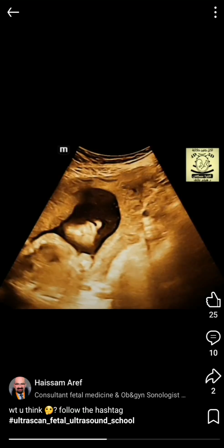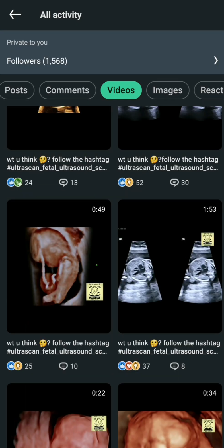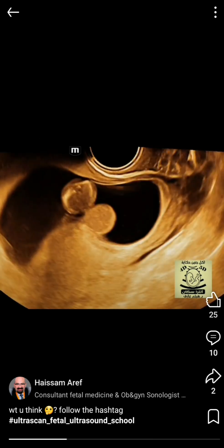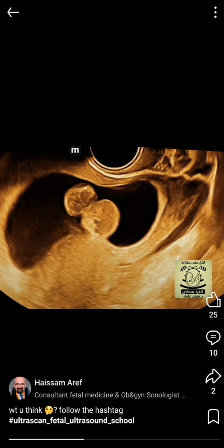We did have here also a case of omphalocele. Yes, we did have here a case of omphalocele, and the omphalocele was containing the small bowel, the liver and the stomach.